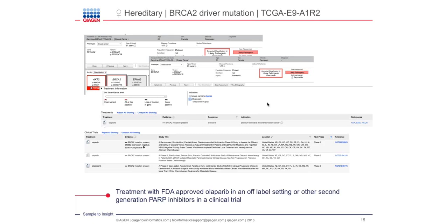The conclusion is pretty similar in this case, but it's just to illustrate how ACMG classification can really differ from case to case. And finally, as I mentioned at the very beginning, we couldn't stop ourselves from asking the question: what about triple negative? What can QCI provide to you when you look into triple negative breast cancer cases?